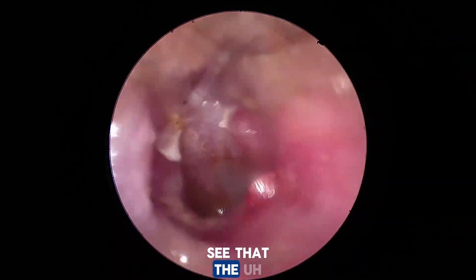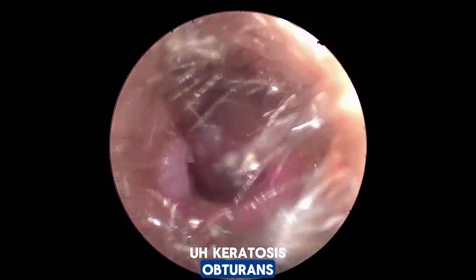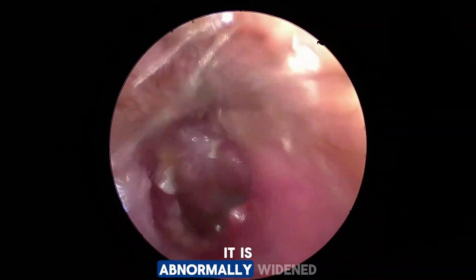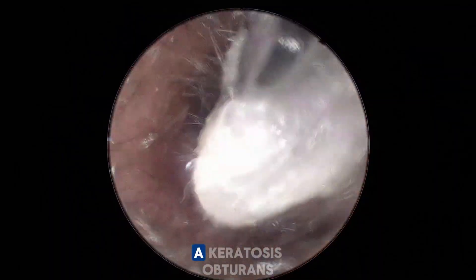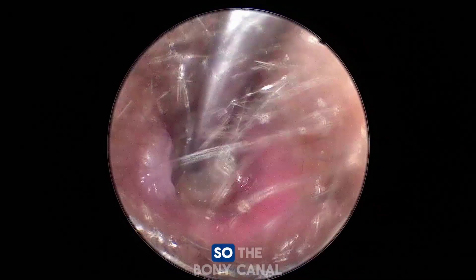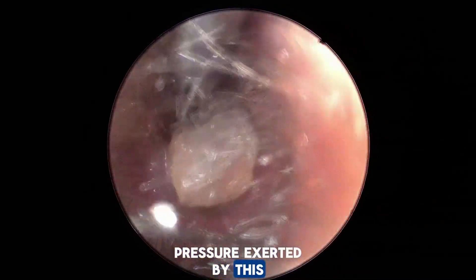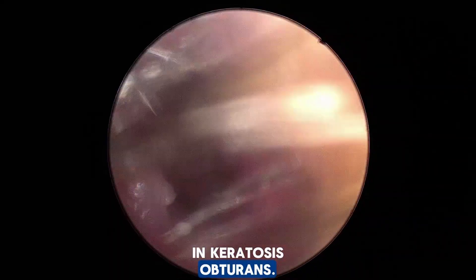Now as you can see, the keratin plug has been removed. We have removed the keratosis obturans and you can see that the ear canal where it was impacted is abnormally widened. This canal expansion is a very strong characteristic finding of keratosis obturans. The bony canal remodeling occurs due to chronic pressure exerted by this keratin plug.